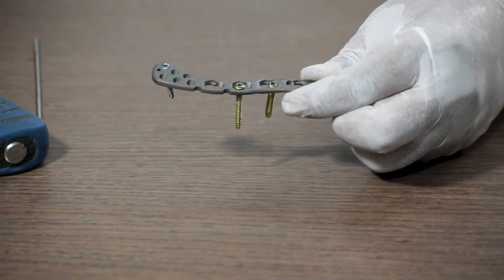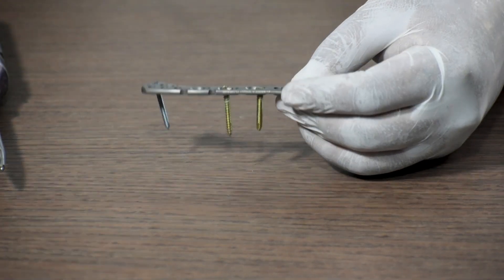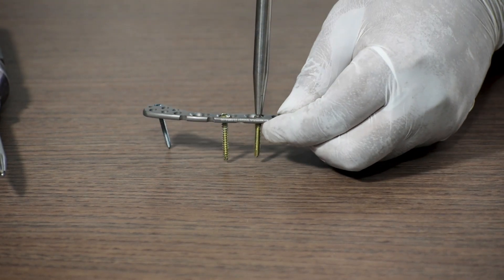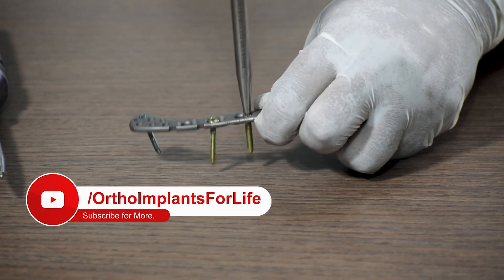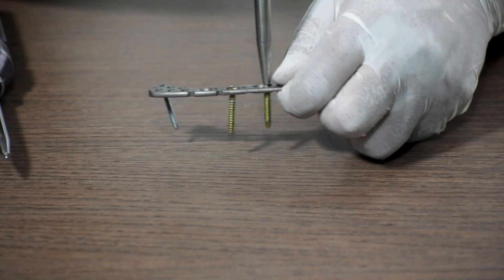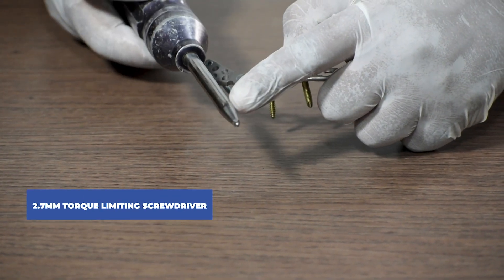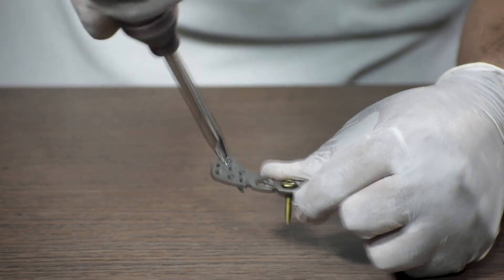Lastly, we take a torque limiting screwdriver to check the torque of the locking screw. The function of a torque limiting screwdriver is to check if the locking screw is fully locked in the plate — as you keep turning it, it will make a click sound once the screw is fully locked. Since we fixed a 3.5 mm locking screw, we use a 3.5 mm torque limiting screwdriver. We use the same procedure for the 2.7 mm locking screw, using a 2.7 mm torque limiting screwdriver.